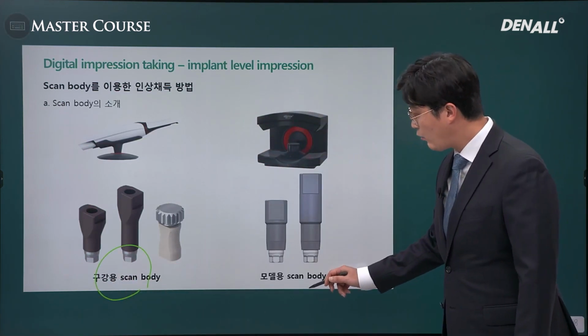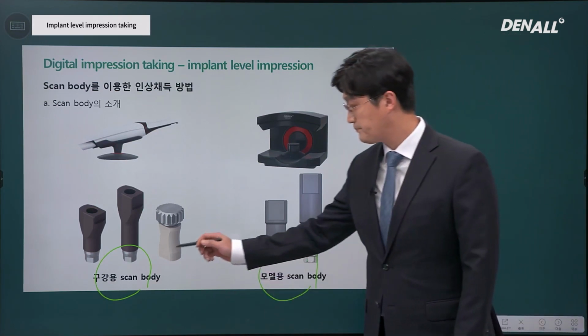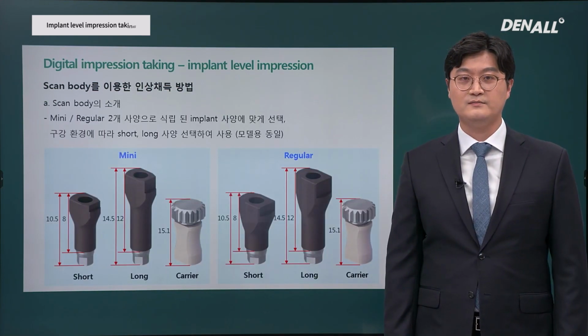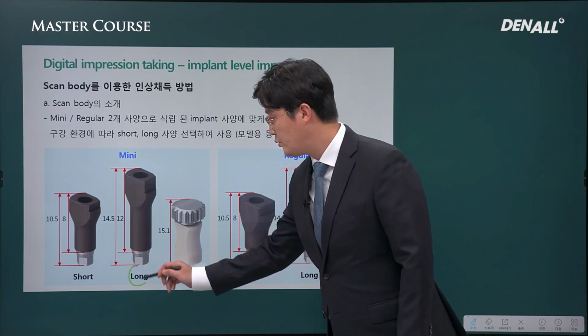Next, there are scan bodies used on the model, and scan bodies used in the mouth. When scanning in the patient's mouth, we use this scan body. Scan bodies also come in long and short types.